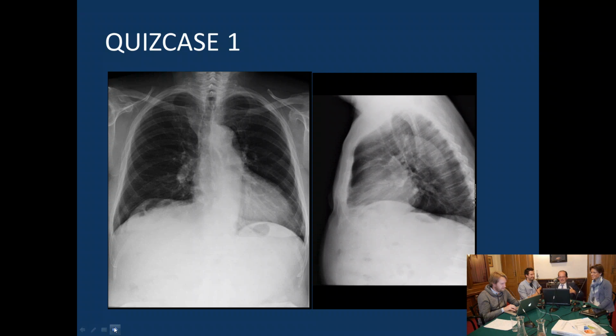Well, Martina and Alexander, both of them are teachers in radiology, and they every month have newcomers, and I would say every third newcomer will see this diagnosis. And do they catch this syndrome? Often not, but if you've seen it once, then you know it. But if you have seen it never, it makes troubles. And when we close the quiz, I will explain you the diagnosis, and I will tell you the story how the name comes from.